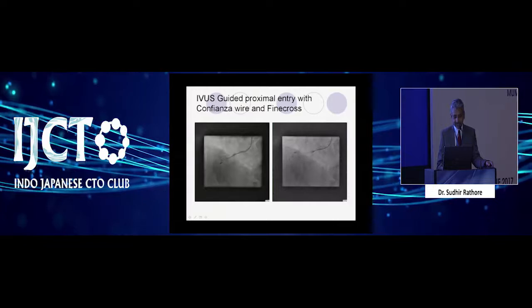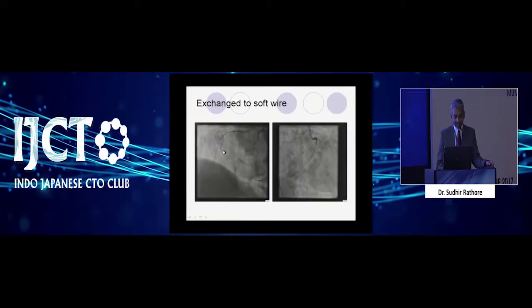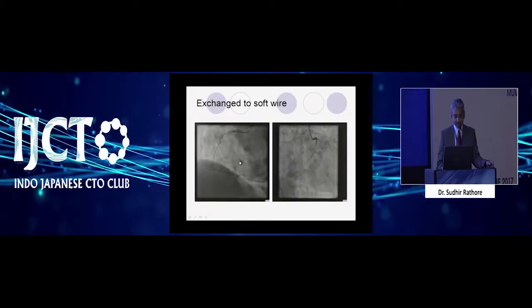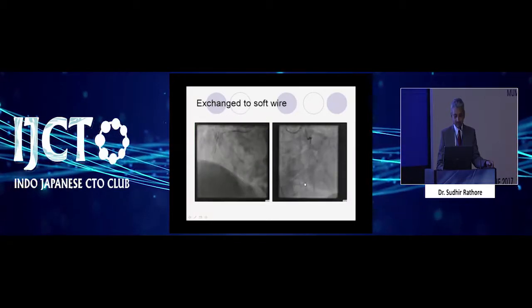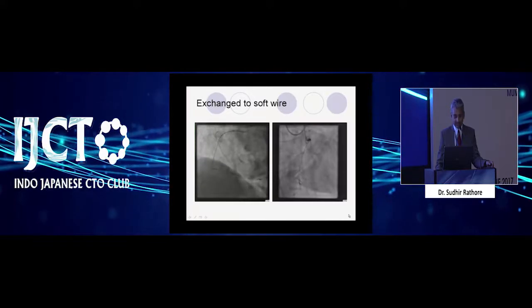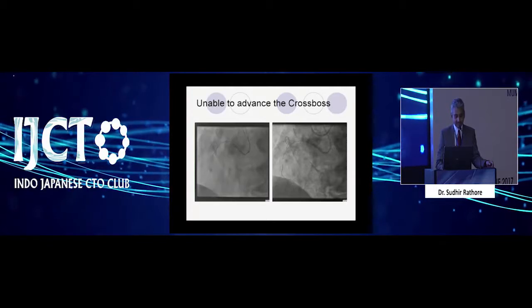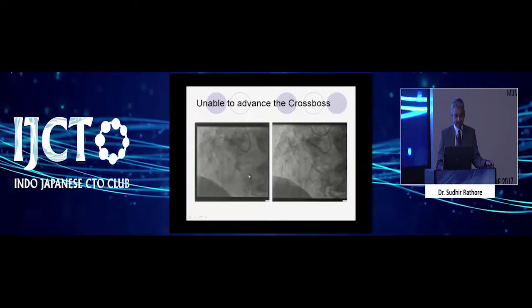We confirmed it here, and we were planning to do the ADR. And then we put the wire further down, as you can see here, and this wire is clearly in the subintimal space. We are not able to advance, and we were not happy with that. So this is where we went.